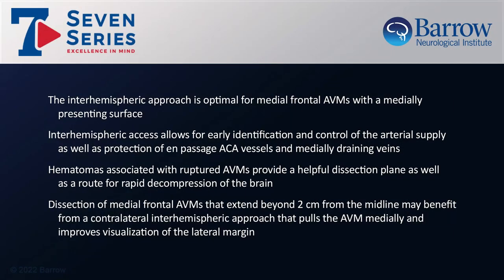In conclusion, the anterior interhemispheric approach is optimal for medial frontal AVMs based on the medially presenting surface. Interhemispheric access allows for early identification and control of arterial supply, as well as protection of en-passage anterior cerebral artery vessels and medially draining veins. Hematomas associated with ruptured AVMs provide a helpful dissection plane and a route for rapid decompression of the brain. Medial frontal AVMs extending beyond 2 centimeters from the midline may benefit from a contralateral interhemispheric approach that pulls the AVM medially and improves visualization of the lateral margin.